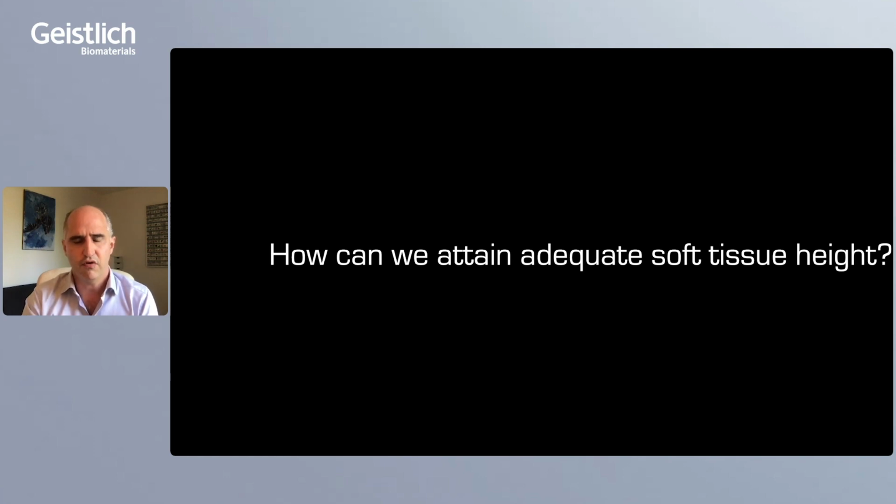So, of course, and this should be the focus of this talk, is soft tissue height. An adequate amount of soft tissue height over your implant fixture seems to be important. We know that a certain amount, Linkevicius has defined 2 millimeters. Today we even think it's probably 3 millimeters, maybe 4 millimeters of soft tissue height over your two-piece implant seems to prevent marginal bone loss.